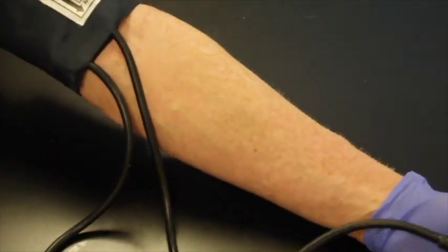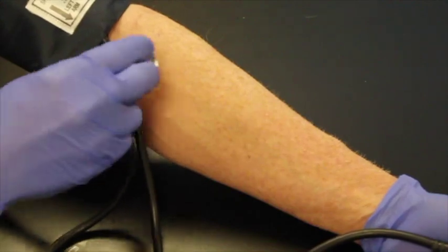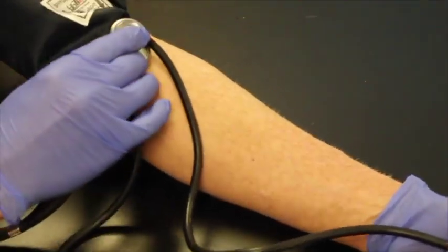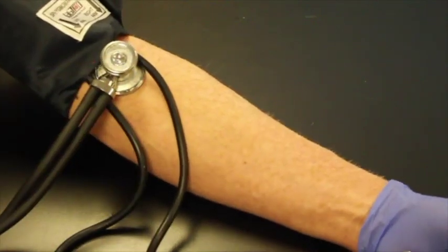Then I'm going to actually need a stethoscope. So we'll get my stethoscope right in there as well so that I can hear this.